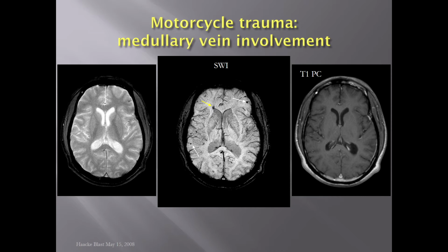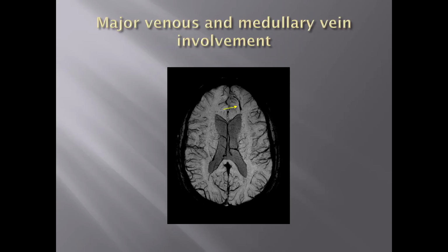If a patient had been in an accident and then complained of some problems, cognitive or attention problems, and then were scanned with these normal methods, the doctor might say, oh, there's nothing wrong with you, you weren't even hurt in the accident. But in fact, these images now demonstrate that the person was hurt in the accident. This can have important implications for the patients who may have trouble working, who may need time off. It may have legal implications for the patient that there really was some damage done.